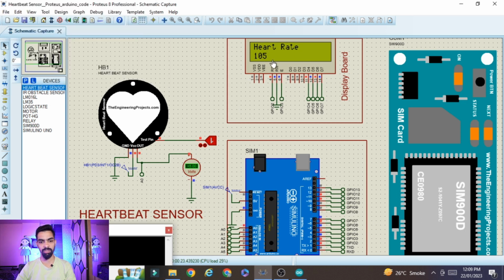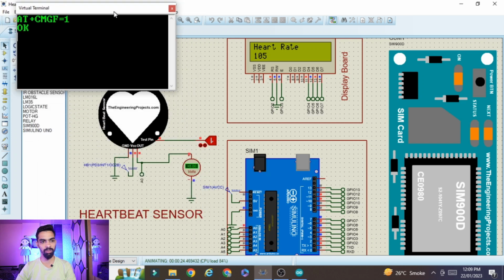Now you can see heartbeat is 105, because timing you can see here approximately 23 is there. After 10 seconds we get the final heartbeat count. Now it's greater than 100, so you can see on the GSM message, and GSM tries to send a message on this mobile number: emergency condition. So this is the one part.